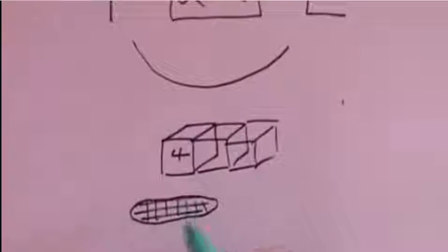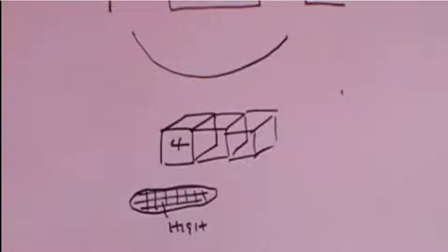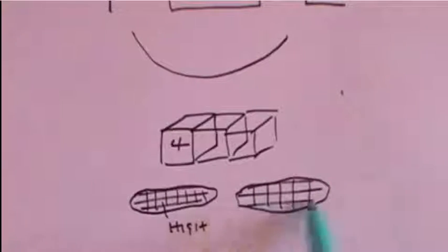In this example, imagine we have a high-density tissue like a bone, and this bone absorbs most of the rays because it's a high-density tissue. So the coefficient of attenuation of that tissue is, as we expect, very high. And suppose we have a low-density tissue like, I don't know, a lung.